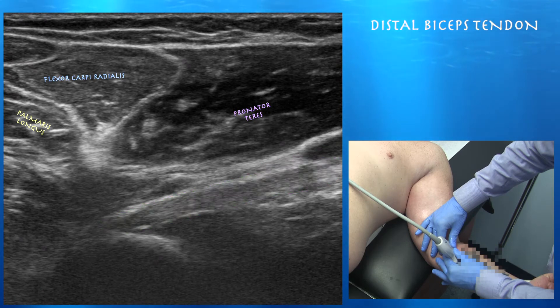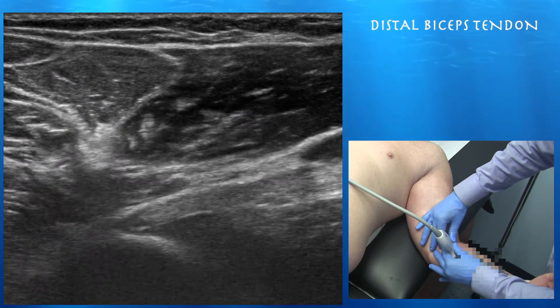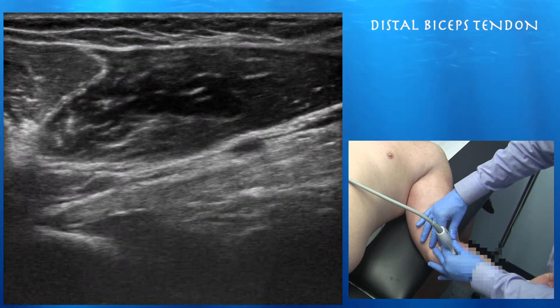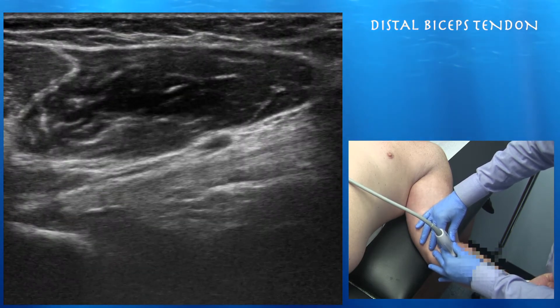Also note that in an axial oblique plane you can see the pronator teres muscle, flexor carpi radialis, and palmaris longus muscles.